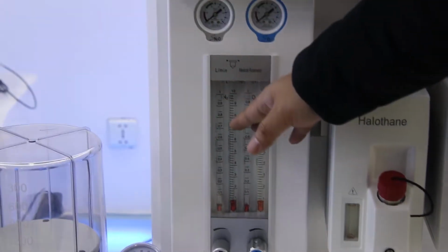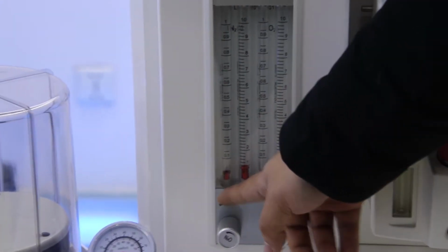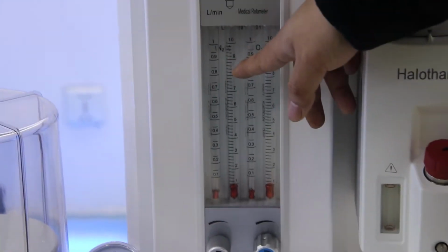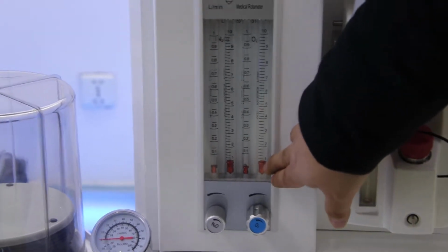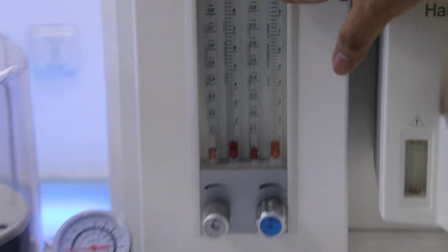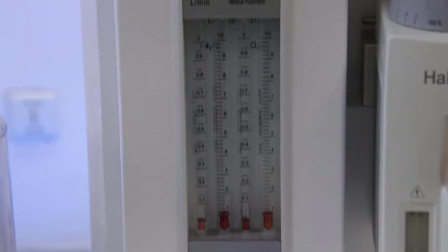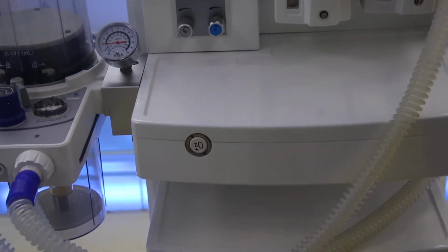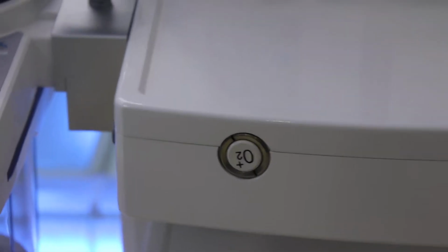And here we see the flow meters. As I mentioned, we can choose the oxygen, which we must have. For the nitrous oxide, we can change it to air. But no matter which gas source, there are two tubes for each, and you can see each one is from 0.1 to 1 and also 1 to 10. It ensures you can set the parameters very accurately. And here is the rapid oxygen supply. This button is usually used in an emergency situation, or after the patient use, when we need to recover the patient soon.